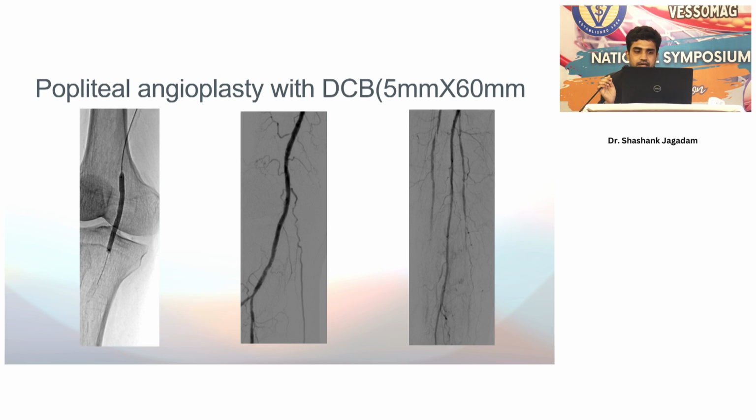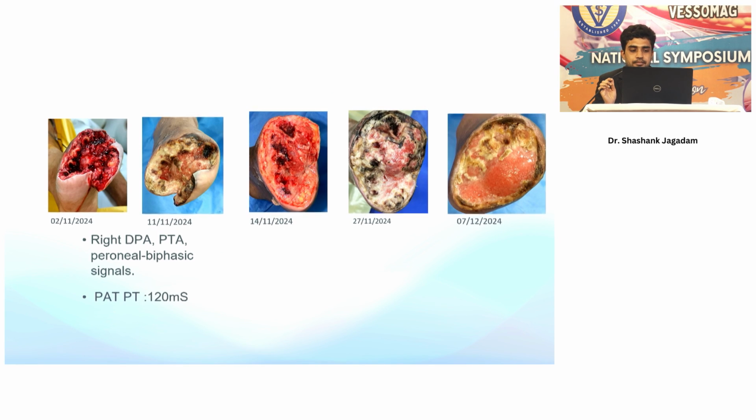Following that, we did popliteal angioplasty with a paclitaxel coated balloon. Post procedure, there were biphasic signals in DP, PT and peroneal. Pedal acceleration time was 120 milliseconds in the PT area. So we went ahead with TMA of the right foot.